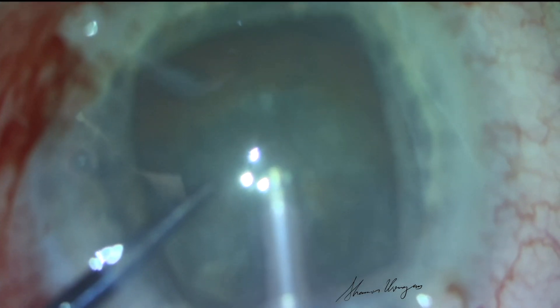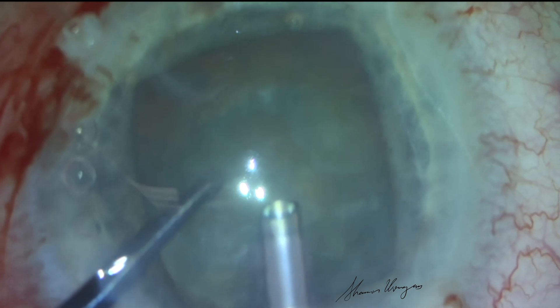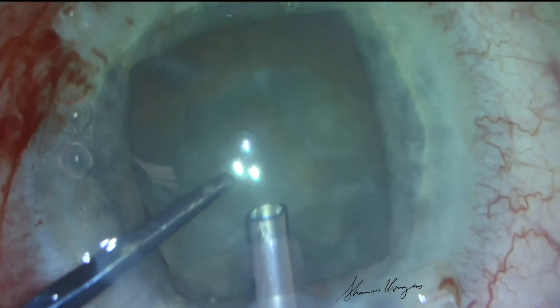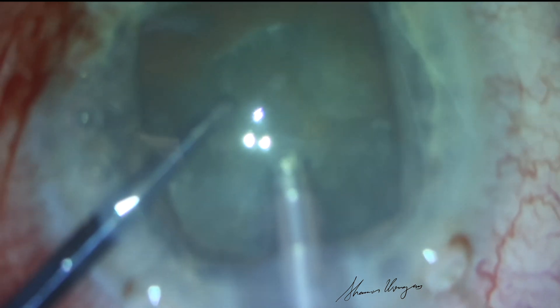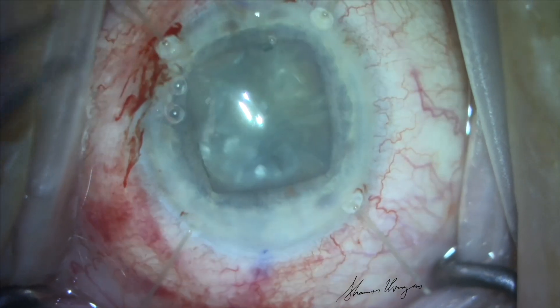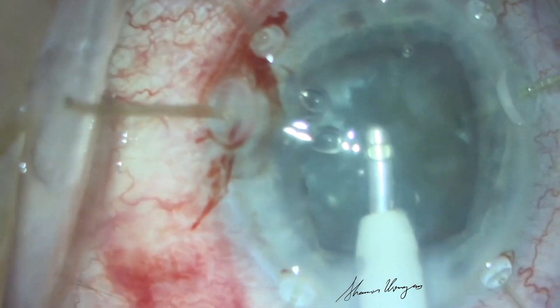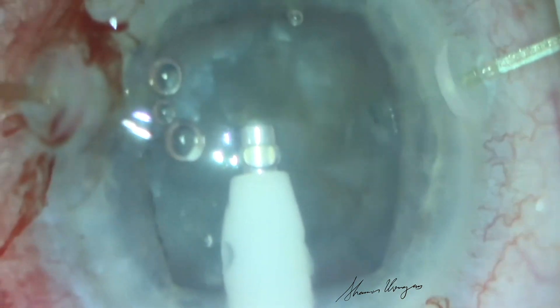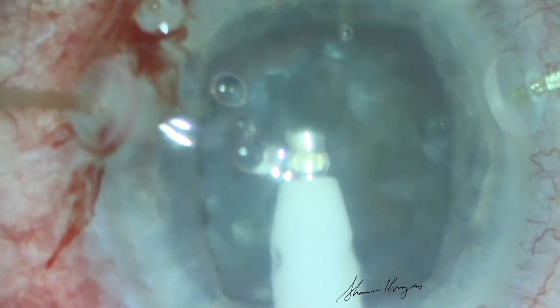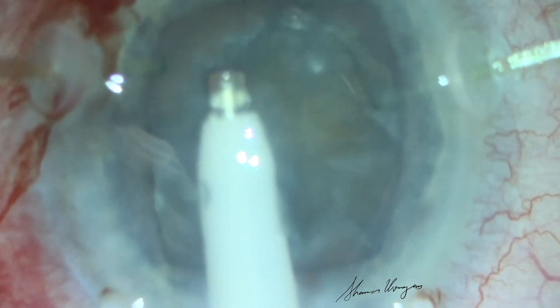As we reintroduce our phaco tip, we again notice the instability of the lens capsule complex between 1 and 2 o'clock. So we choose to place capsule retractors made by MST microsurgical at 12, 3, and 9 o'clock. Anterior vitrectomy is performed with the thought that there is possible vitreous prolapse around the zonules that may be contributing to the trampolining of the lens capsule complex during phacoemulsification.